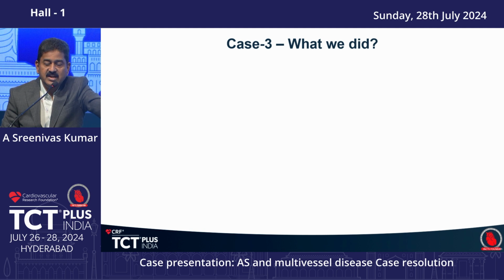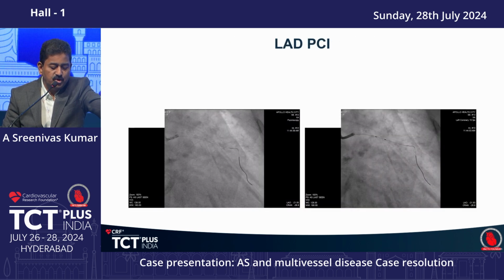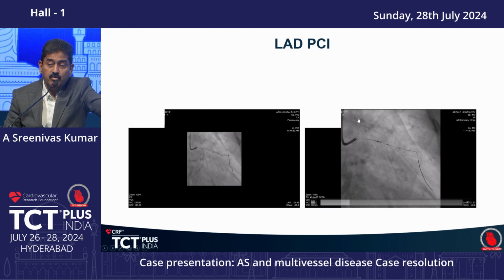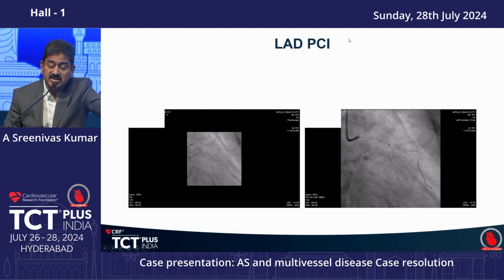The last case I think is a relatively simple one. This we could come across. Some people could argue that you may avoid doing anything, but it was proximal LAD, we thought we could do it. Otherwise, if it was more distal, we could have left it. But proximal LAD and critical, then we thought we can do PCI in both in the same sitting.